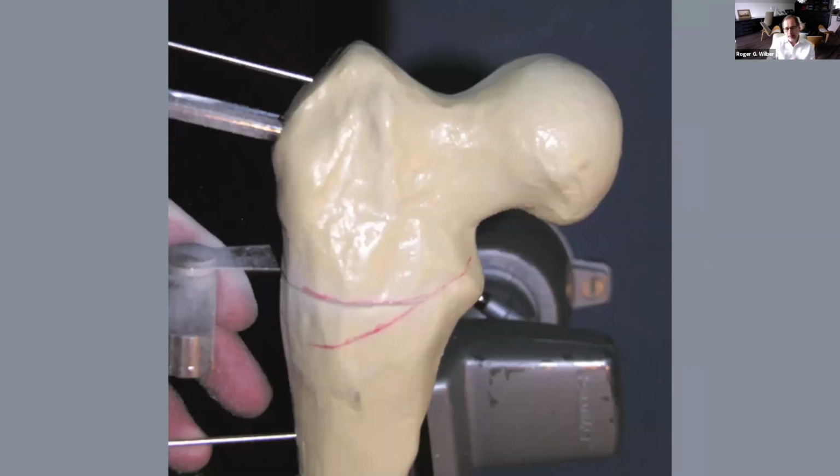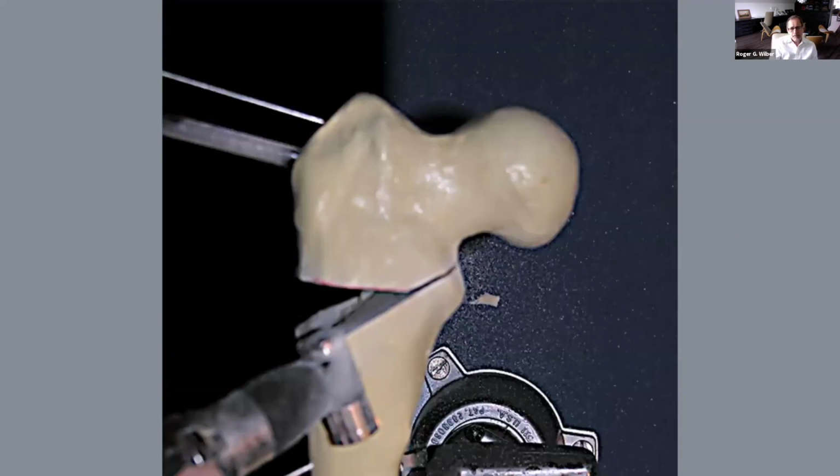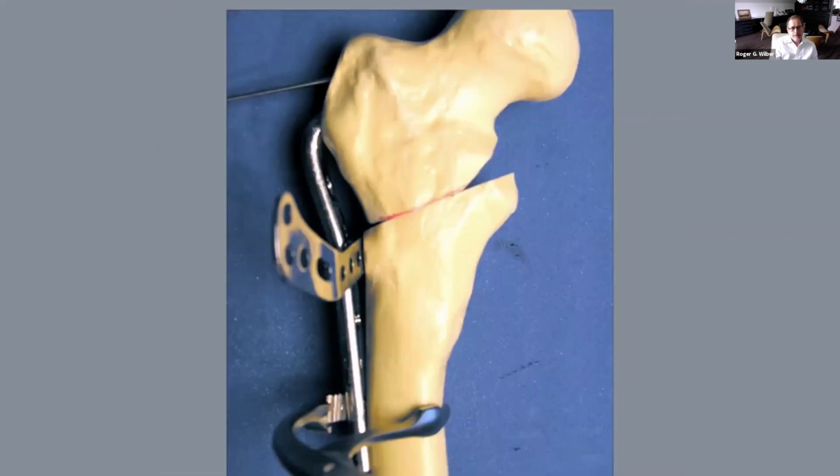Then you have to make a couple of cuts. I tend to make the short cut first and then make the longer cut after that. You do have to come in and out a few times. I suggest that you use very thin blades for this. I tend to use a 0.6, not even a full millimeter, about 0.6 millimeter blade. It's flexible, but it'll give you a really nice cut, and then stop there and then make the long cut after that. Sometimes you have to actually rotate the femur a little bit in order to complete that cut.